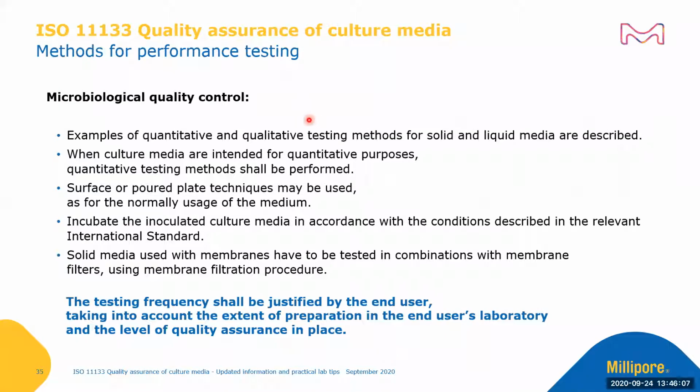The microbiological quality control is given in detail in the ISO 11133 for the performance testing. Examples for quantitative and qualitative testing for solid and liquid media are described. When culture media are intended for quantitative purpose, quantitative testing methods shall be performed.